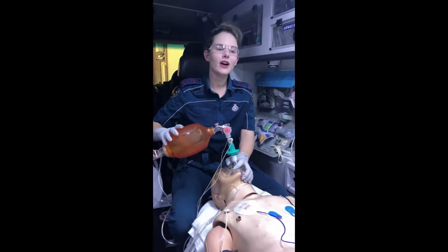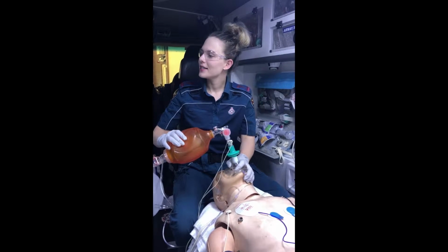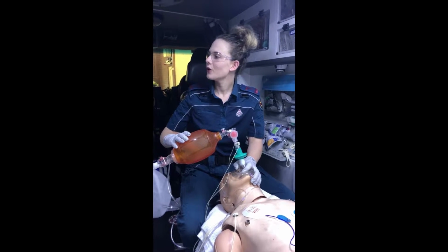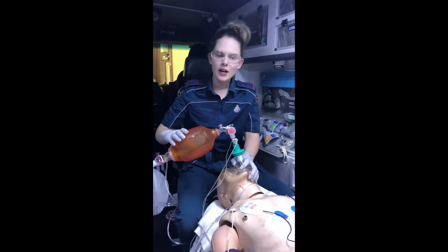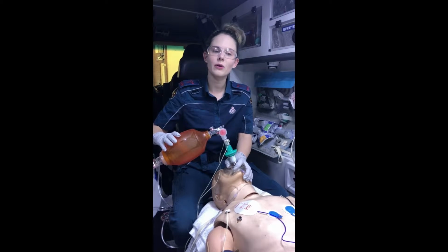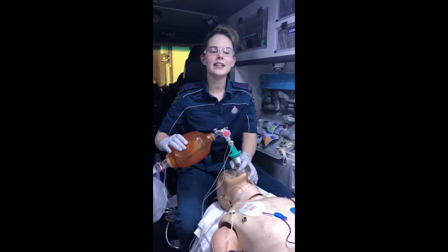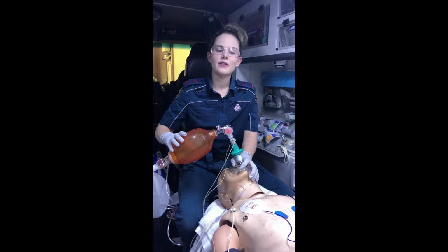My name is Stephanie and I'll be the team leader and the first intubator. Stuart, you'll be the airway assistant. Are you familiar with all of the equipment? I am. So first I'll get you to hand me the bougie, and when I say railroad, the tube over the top. Okay. Ted, you're in charge of the medications. We've previously discussed the medications, the dosages and time. Do you have any questions? I don't. I'll also get you to monitor the patient vital signs, and if there's any change, please let me know. I will. Alright, we're ready to complete the RSI checklist.